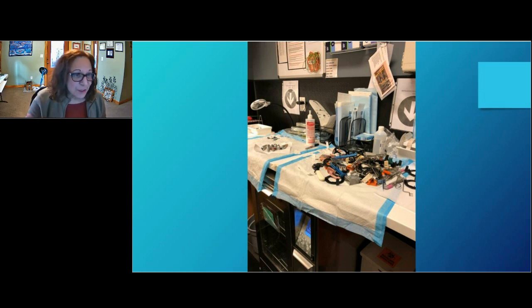The instruments are not dirty, but they're not microorganism free. I hate to say free, but they're not decontaminated. In this practice, once the items were packaged, even on the clean side, they would handle them with gloves until they put them into the sterilizer. Then the gloves were removed, and once the instruments came out, that was the only time you could handle them without having to wear PPE.